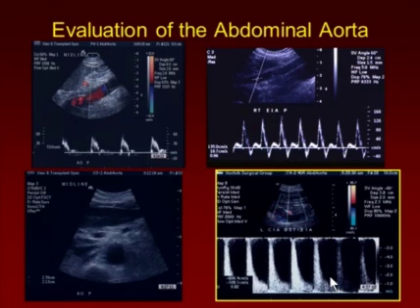When you do encounter a stenosis, as seen here in a common iliac artery, we want to sample prior to the stenosis and within the stenosis and document the peak systolic velocity, and then also document the post-stenotic turbulence that's present.